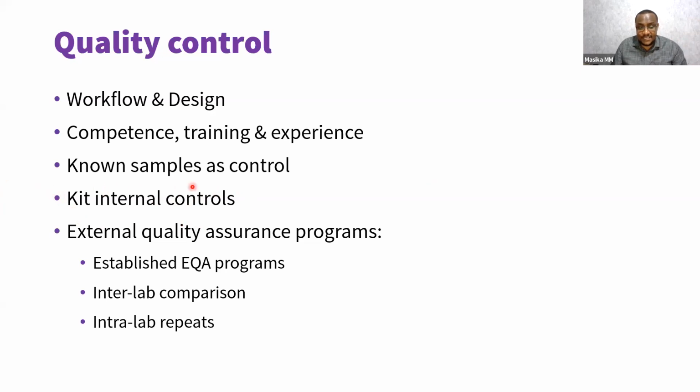And if you guys have seen Gene Experts, they are very good internal controls for their kits. Also, in fact, for Gene Expert, if you put the wrong sample, like if you're supposed to put sputum and you put urine, it will not read. It has those controls. External quality assurance programs are also established, but this will be done as a topic later.